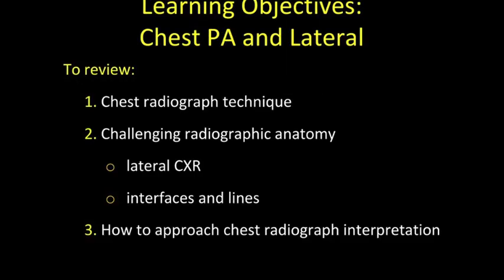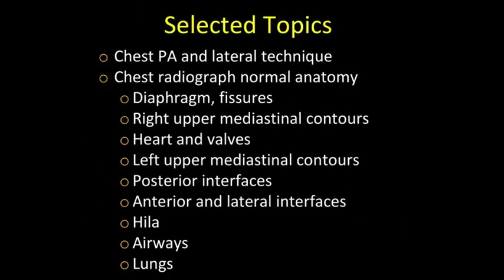Our objectives are to cover technique, some basic and challenging radiographic chest anatomy, and provide a general approach to chest radiograph interpretation. Here are our selected topics, ranging from technique to normal anatomy.